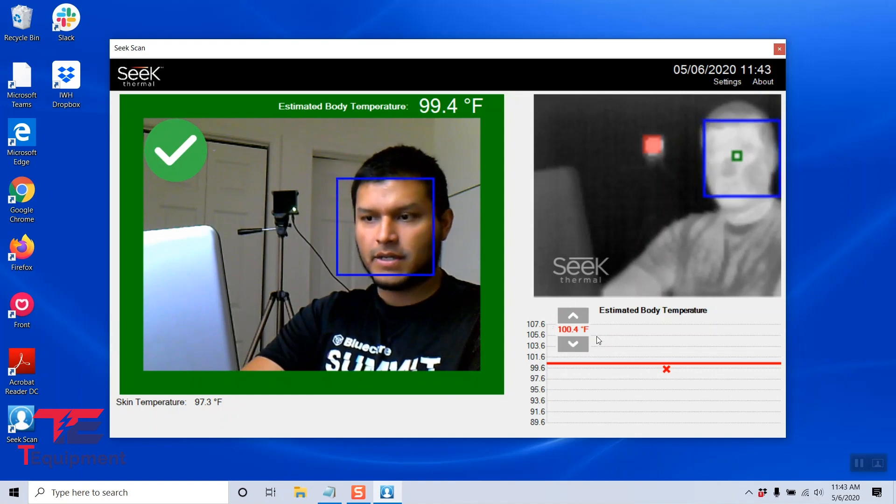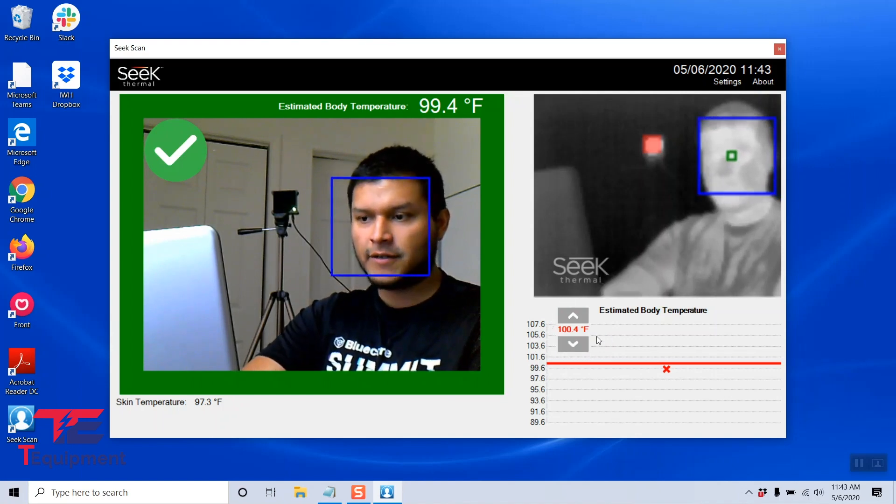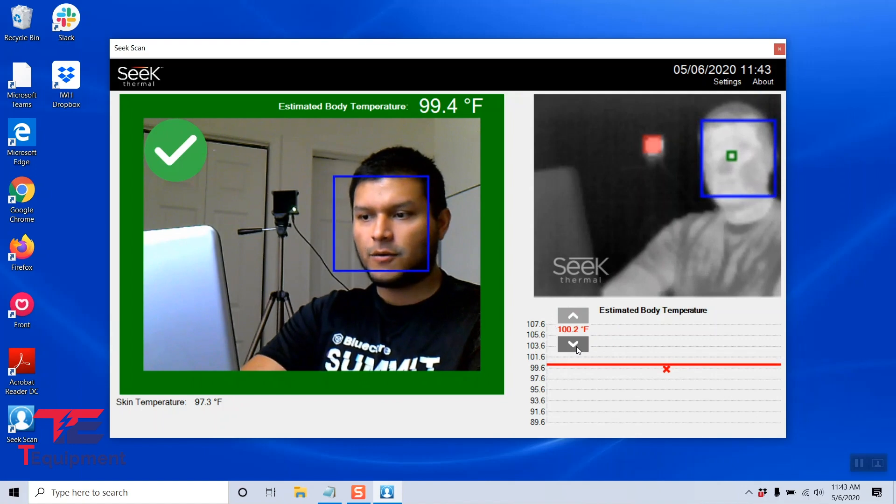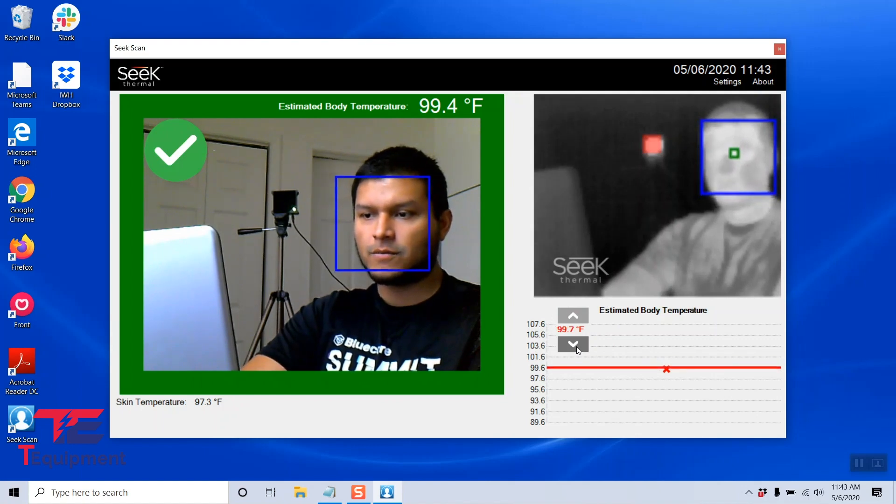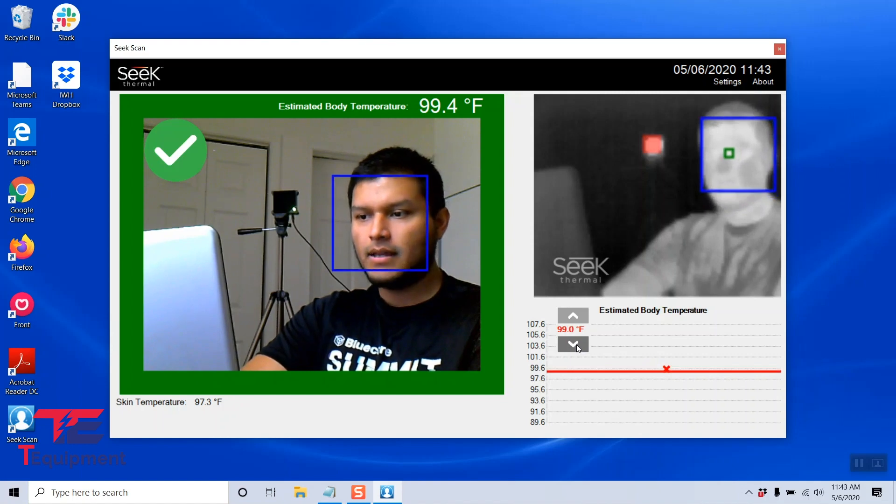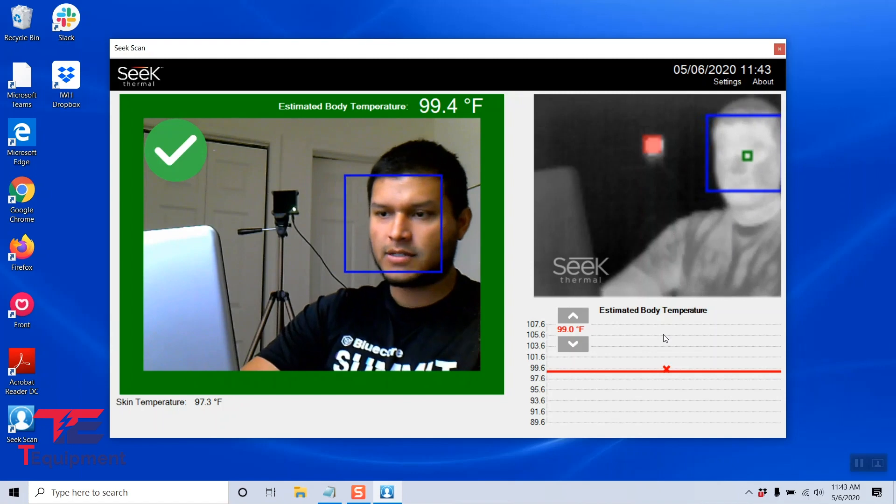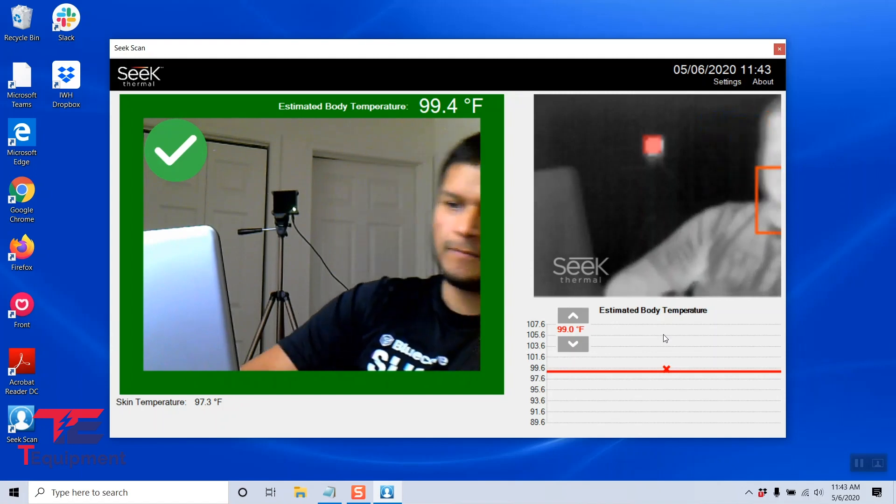So basically when that fail alarm triggers here, I'm going to go ahead and lower this to a temperature below my current reading. I'm going to make it 99.0 degrees Fahrenheit in this case, and I'm going to step out of the frame.